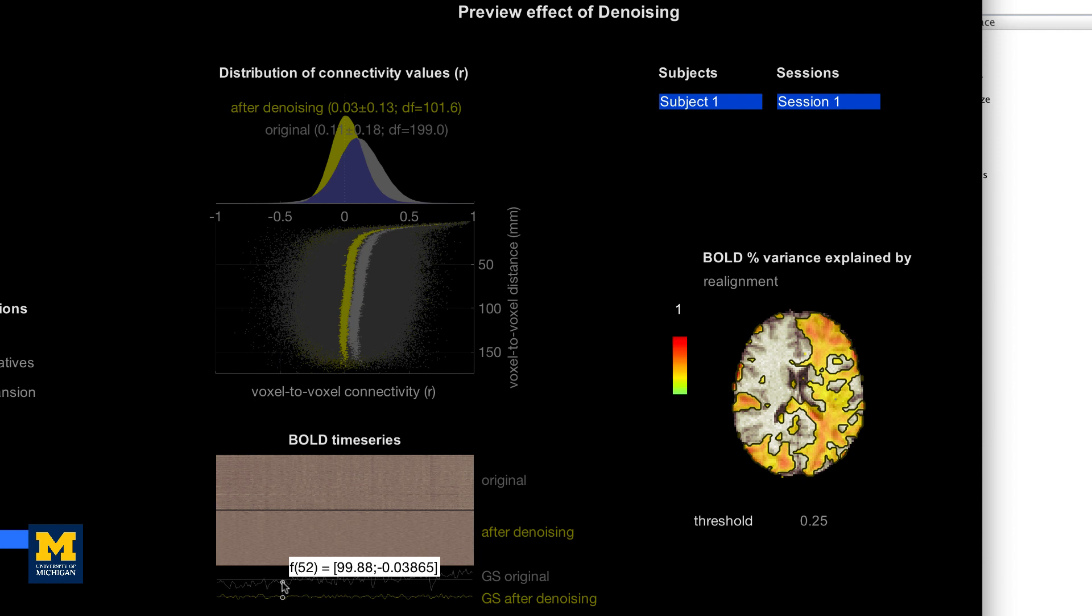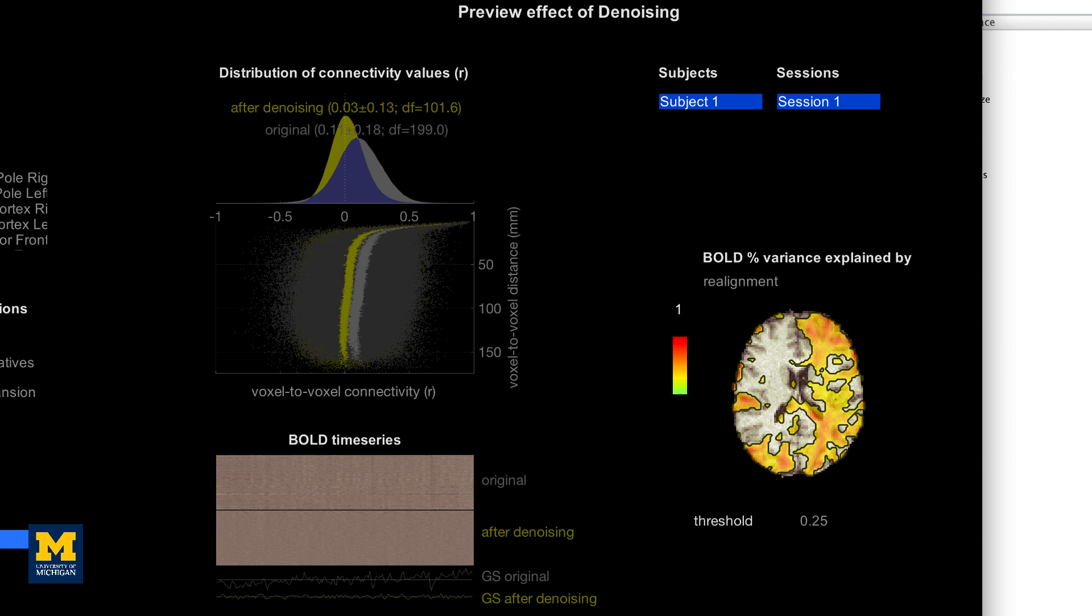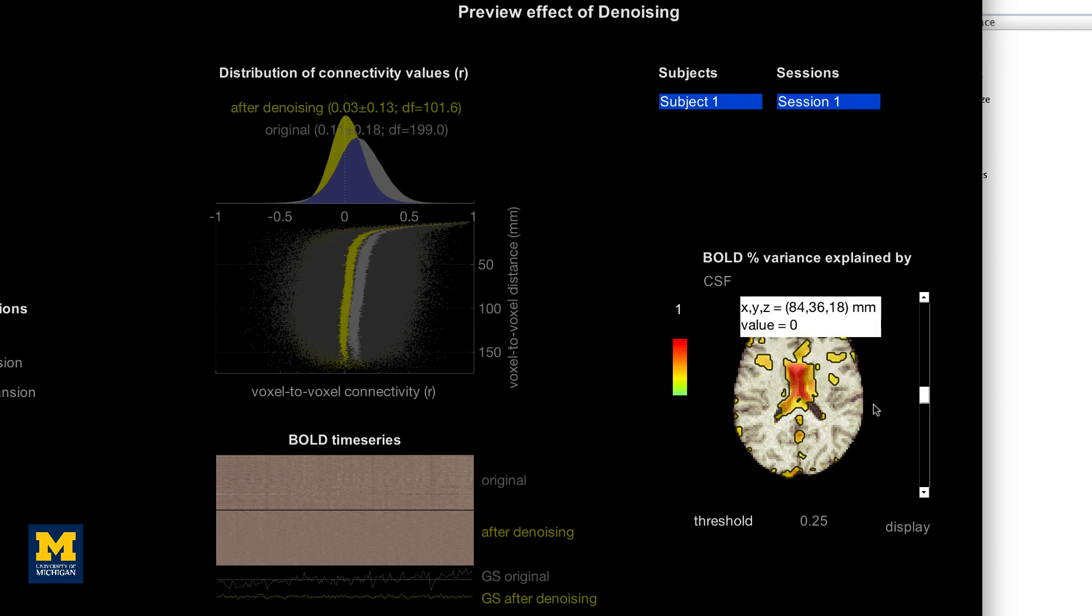Lastly, the preview brain on the right hand side shows the percent of variance in the BOLD signal explained by the currently highlighted confound regressor. The loading of the explained variance should correspond to the regressor that is highlighted. For example, without me showing you, can you guess what this confound regressor represents? Do you think it is movement, the white matter components, or the cerebral spinal fluid components, and why?